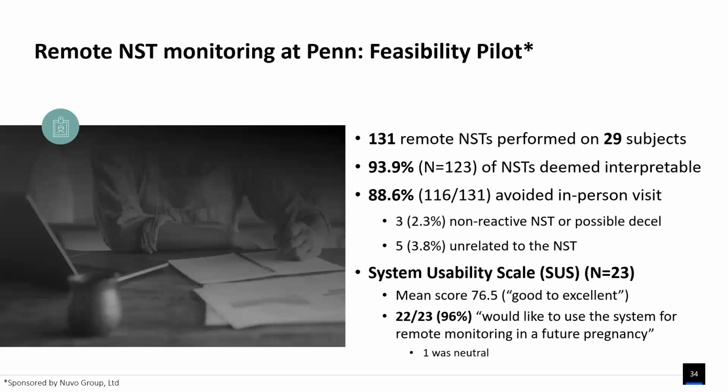So it's not necessarily just from the tracing. And we did a usability scale survey as well, and they all felt that they were able to use the system. They would want to do remote monitoring in the future. 96% of the respondents said that as well. So it is feasible. The technologies are out there, and more technologies are coming to market.